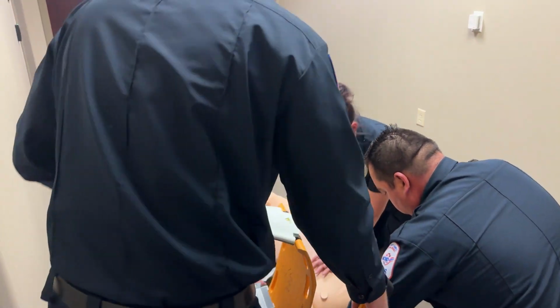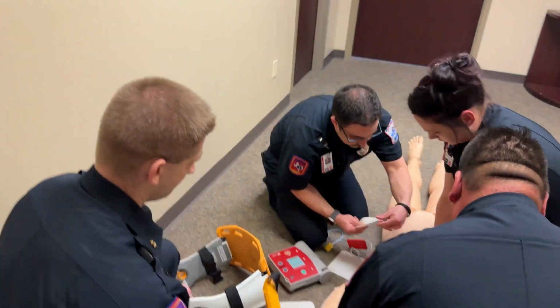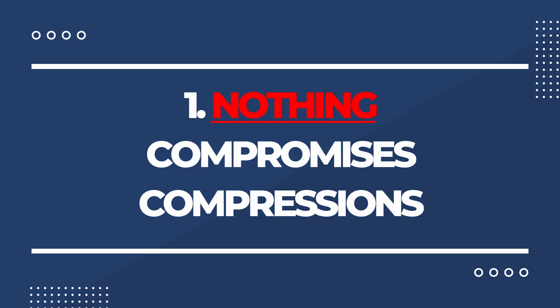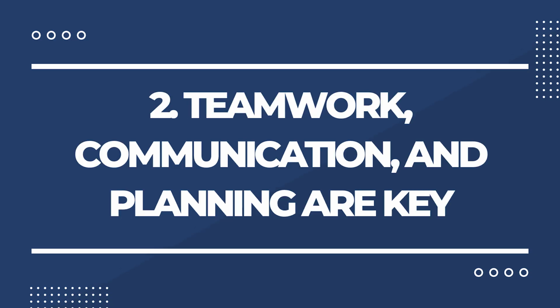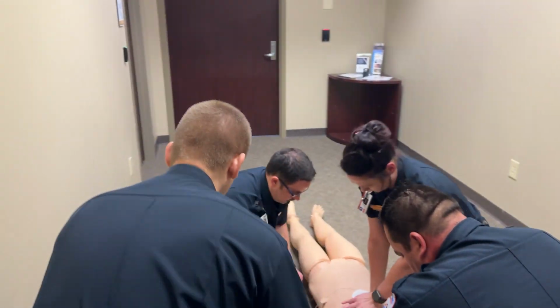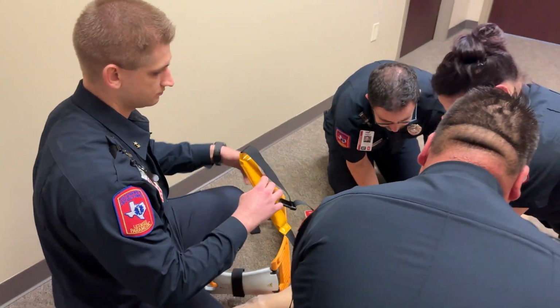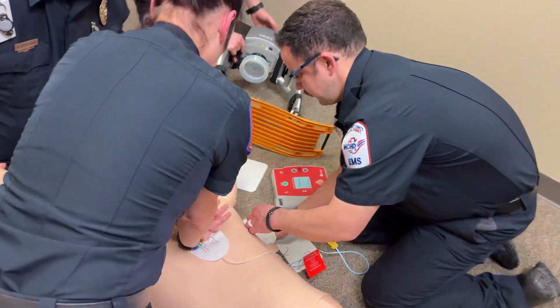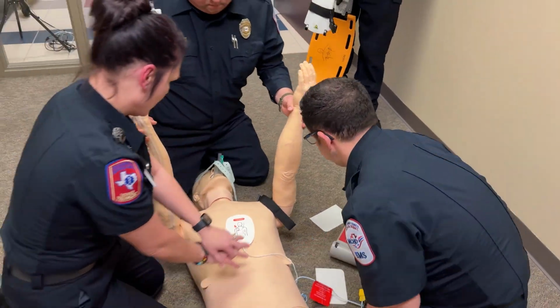As you can see, rule number one for our pit crew CPR across the county is nothing compromises compressions. Teamwork and communication are key. As you can see, when the first pad was placed, it was timed with the team member doing compressions to minimize that pause and make it as brief and as quick as possible.